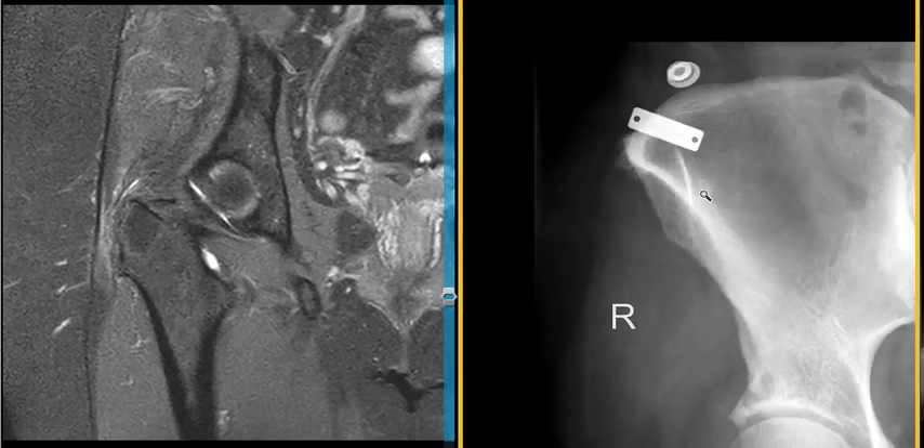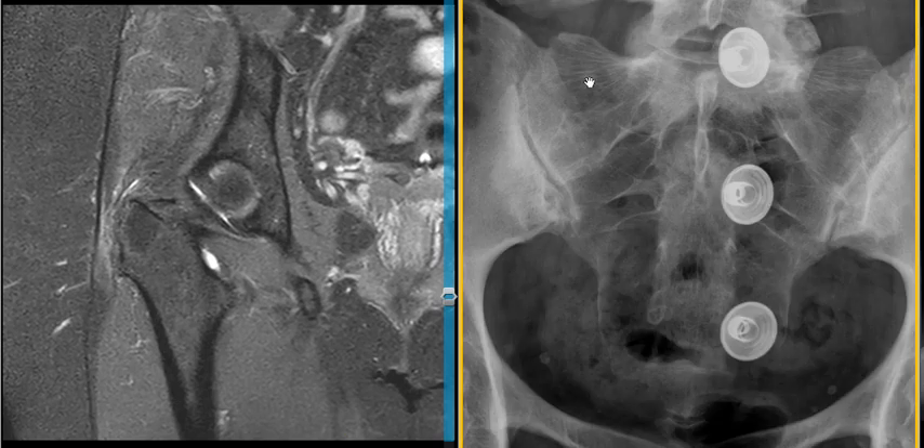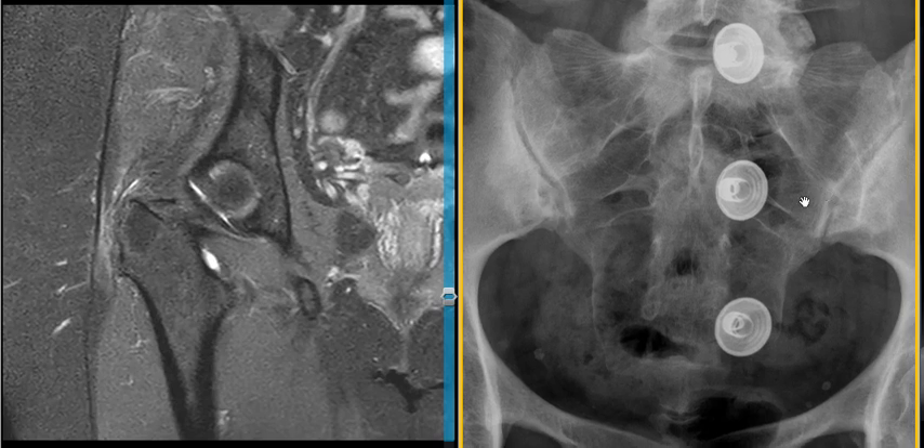One last place to look is the SI joint. Here is the right sacroiliac joint — on the ileal side we see increased density, which is bone sclerosis, and there's some scalloping along the inferior margin, indicating erosive changes. This is evidence of right-greater-than-left sacroiliitis.